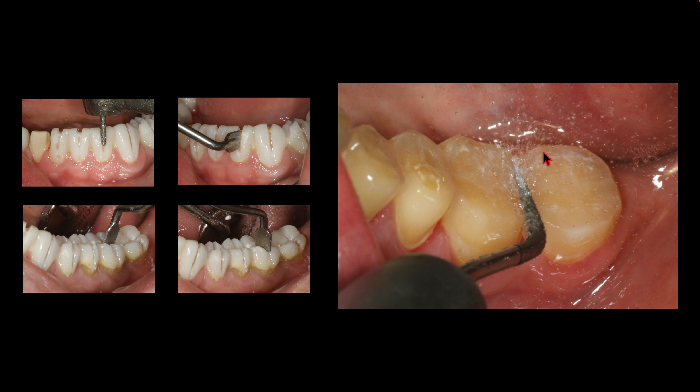The other use I have for this instrument is removing spot-bonded provisional veneers or onlays. I cut slots in them, ideally with the KS0, and then go in and torque the provisionals off. It breaks them, but you're spot-bonding your provisional veneers anyway. I spot-etch a really small circle, and then I put a desensitizer — usually G5 or Gluma desensitizer — on the prep.